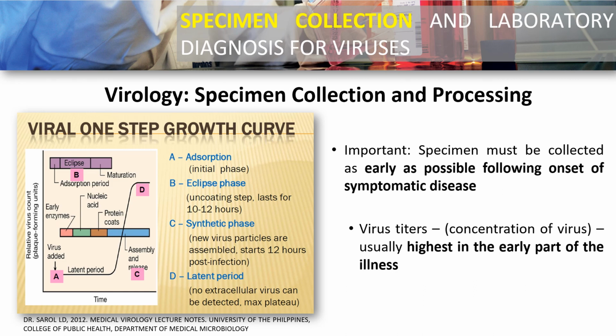For the specimen collection and processing class, it is also important to note that the specimen must be collected as early as possible following onset of symptomatic disease. This is somewhat difficult in Philippine settings. Why? Because Filipinos usually don't go to the hospital and get consultation unless they are severe or kung hindi na talaga kaya.